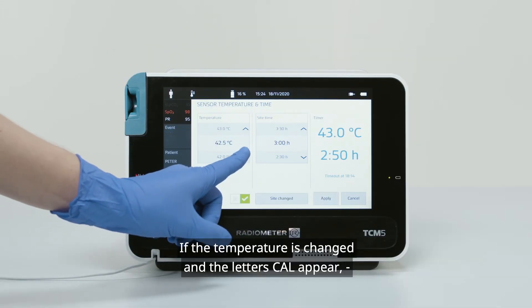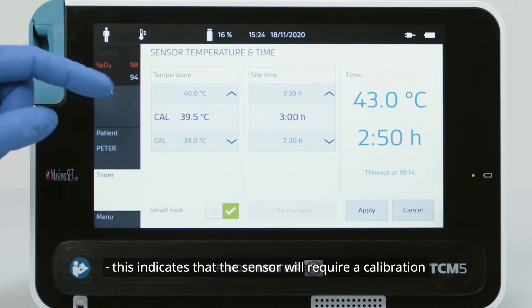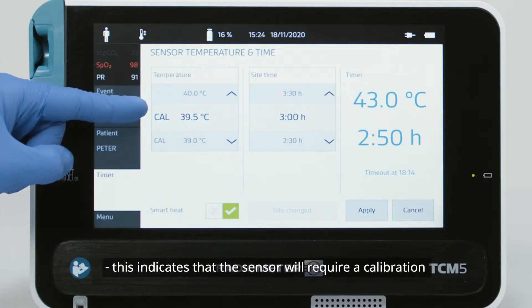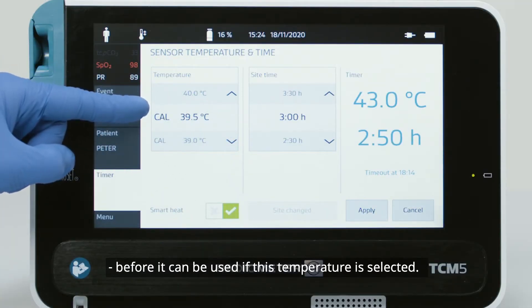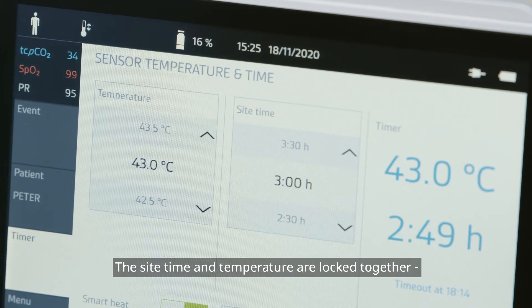If the temperature is changed and the letters CAL appear, this indicates that the sensor will require a calibration before it can be used if this temperature is selected.